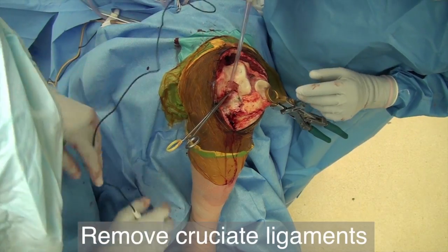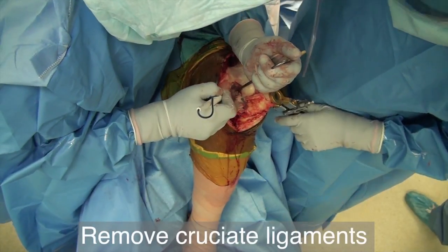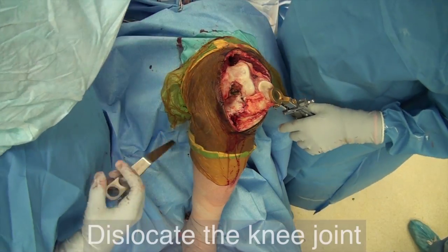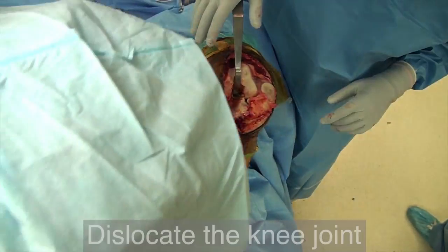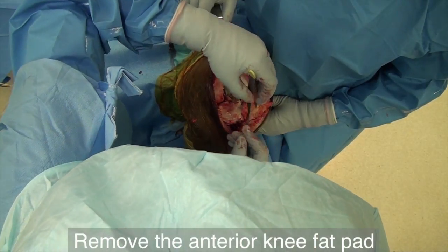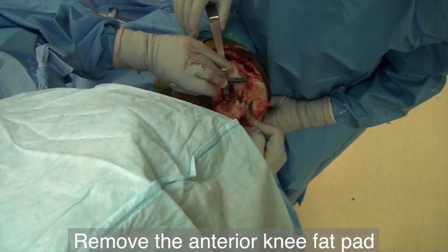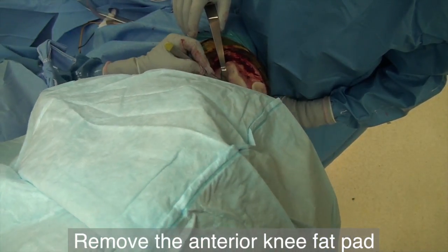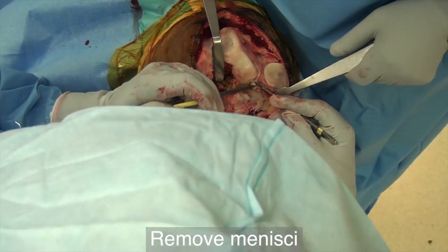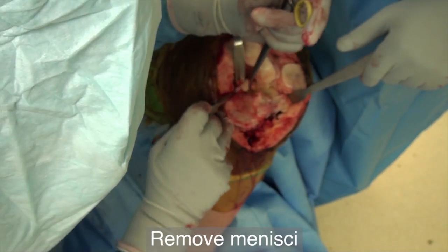Remove both cruciate ligaments. Carefully place the double-angle Hohmann retractor behind the posterior aspect of the tibial surface and dislocate the knee joint forward. Remove the remnants of the anterior fat pad from the patella tendon. Remove the lateral and then the medial meniscus.